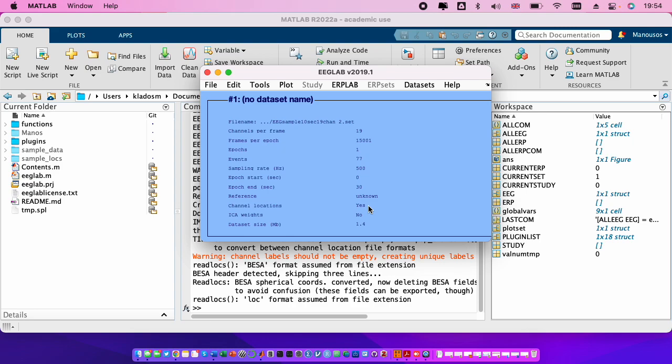We press ok and we see now that the channel location changed to yes. Some amplifiers give you on the data set the one that they save, only the channel names. If the channel names are according to the international system we said, the EEGLAB can detect them automatically, by means that the EEGLAB will put the coordinates of the electrodes automatically.